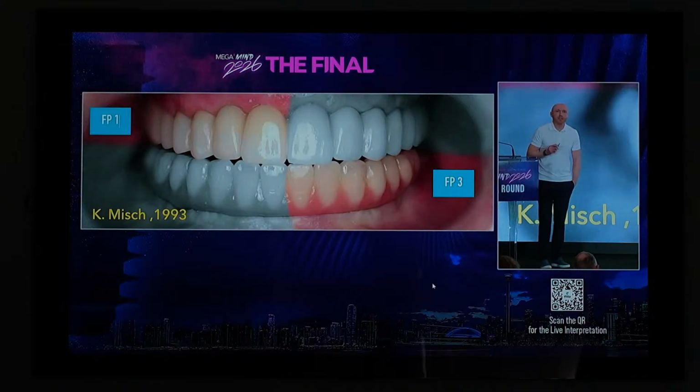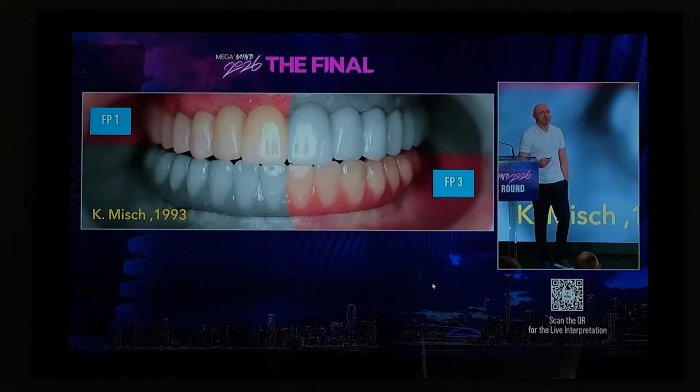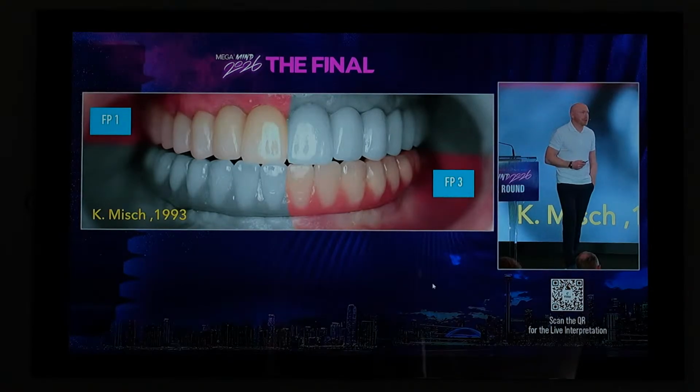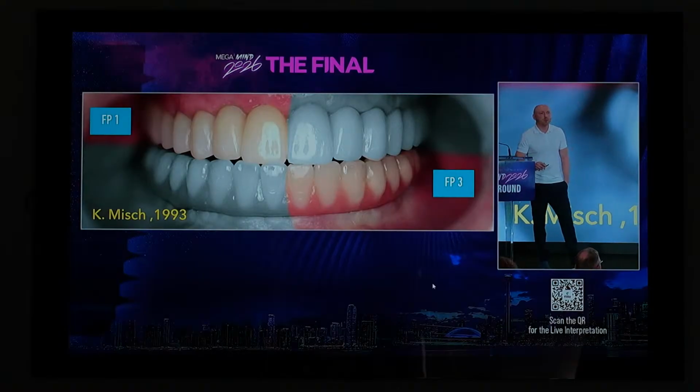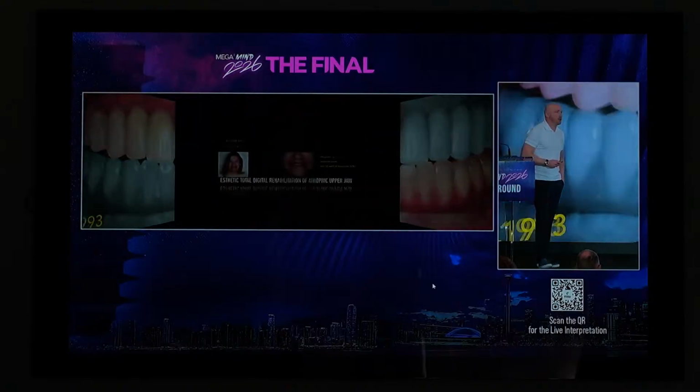And the second one is FP1 type of prosthetics. It is more difficult, more aesthetic, it's about digital protocol, navigation surgery, and the milling process. And today we will speak about FP1 type of construction as the most aesthetic one.